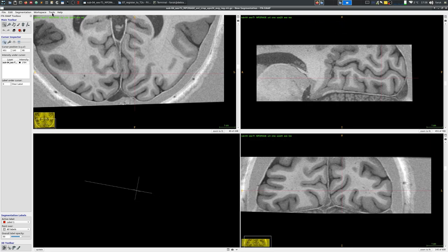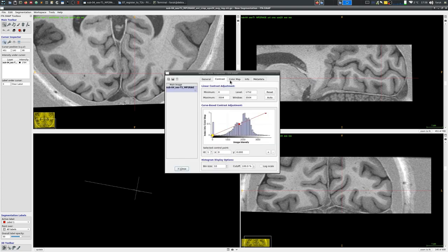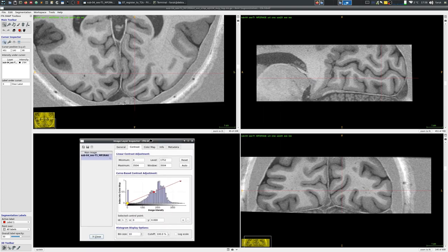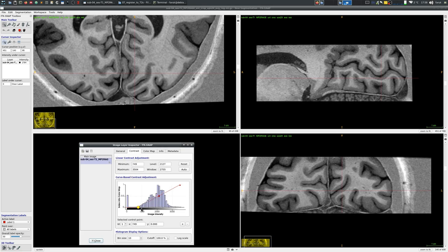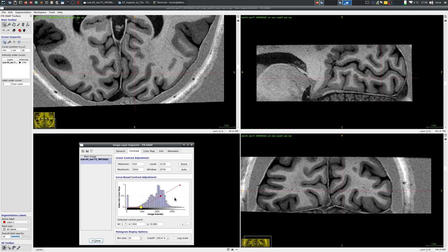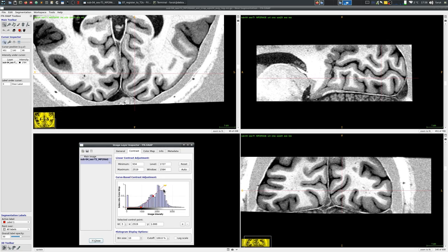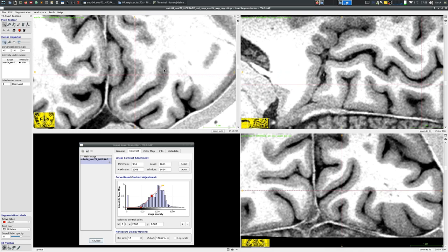Now I'm navigating towards the contrast menu. Here you can see that I'm changing the minimum and maximum bounds of the color map. The end effect is that you get whites whiter and darks darker.